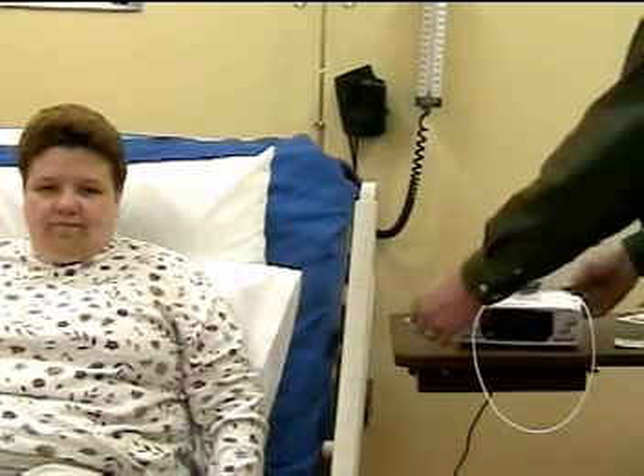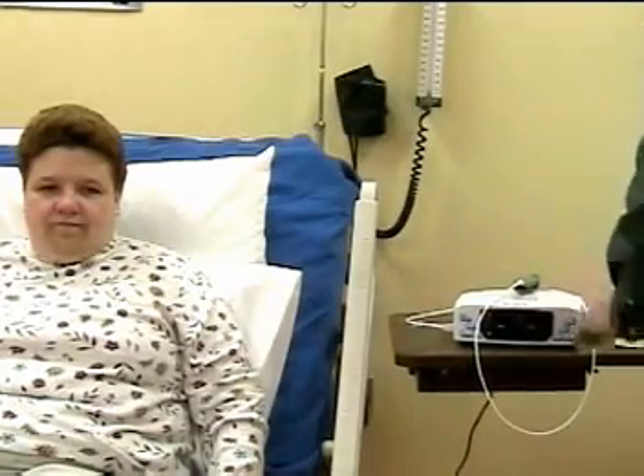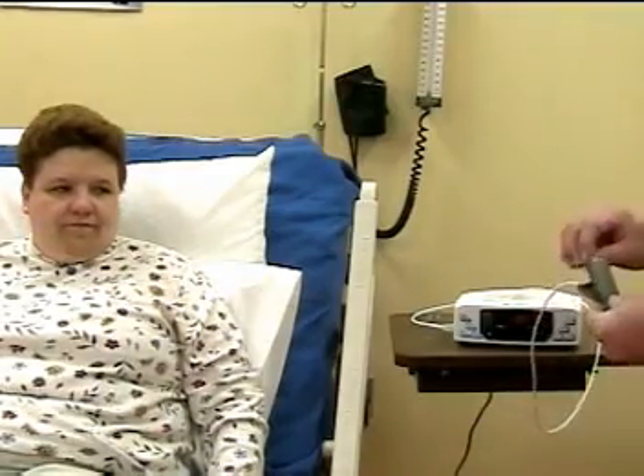If it's electrical, you'll need to connect the power to the electrical outlet, and then connect all of the equipment to the oximeter — the finger probe to the right outlet and the power to the correct outlet as well. Turn on the power switch, make sure the unit is working, and then wipe the finger sensor off with alcohol.